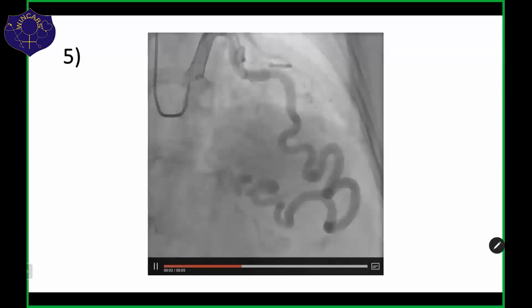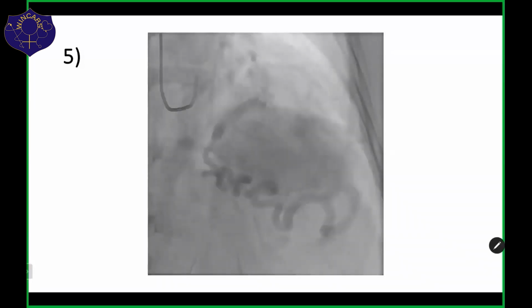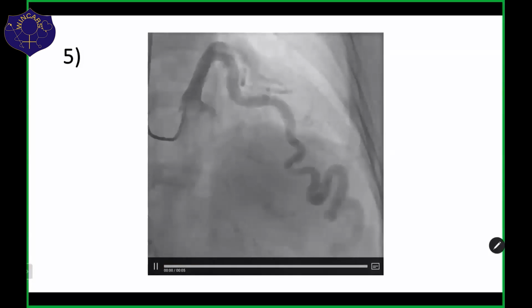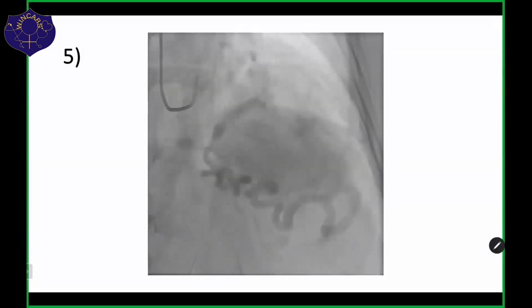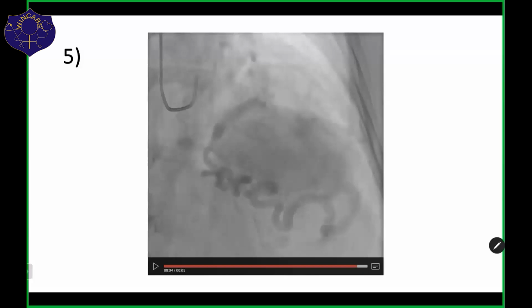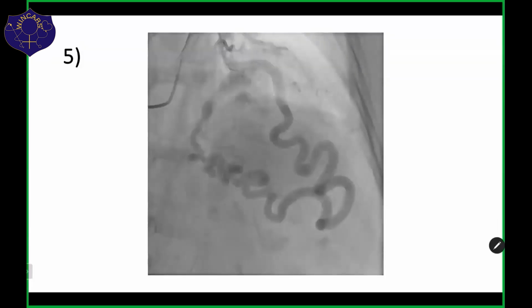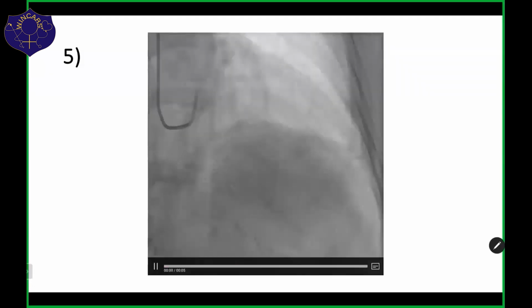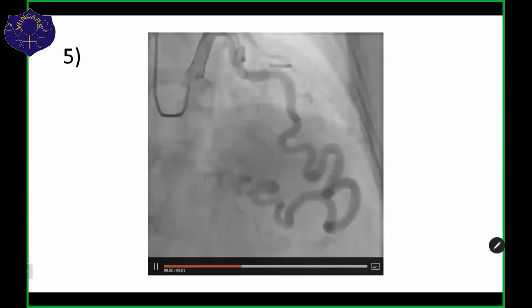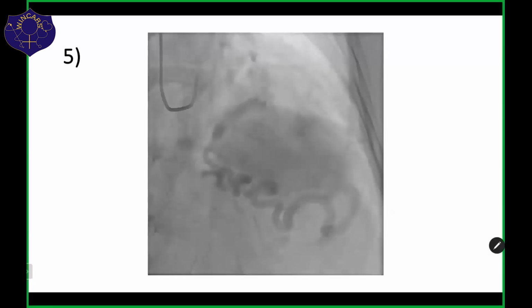Madam, my only worry is the extreme tortuosity of the tip of the vessel after the apex. So if we plan for any device closure or a vascular plug, it's extremely difficult for us to go through this tortuous segment. Reaching this from the right side of the heart, I don't know. That's the reason I asked Usha. I don't know whether she's there.